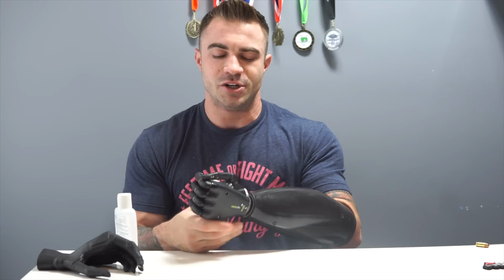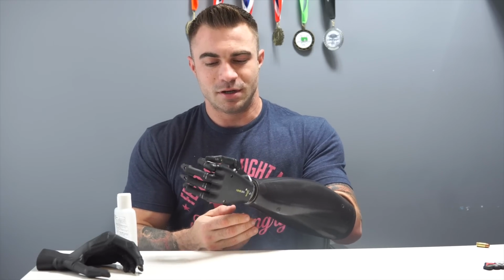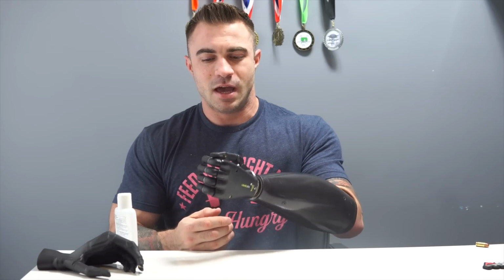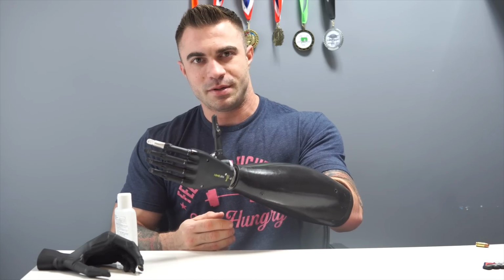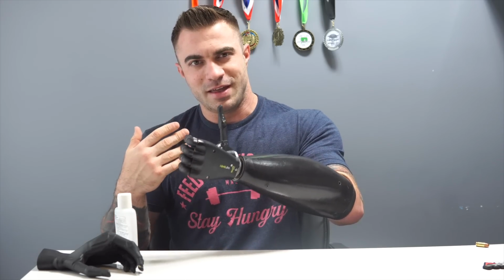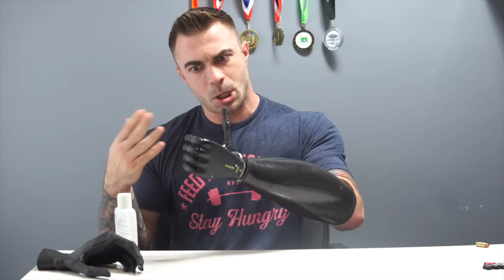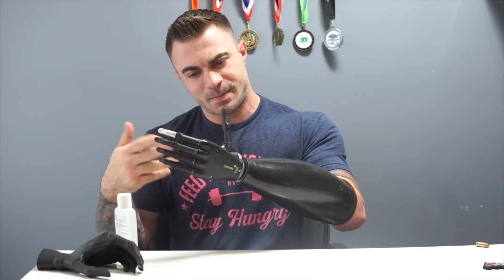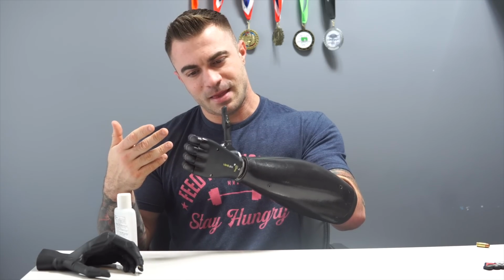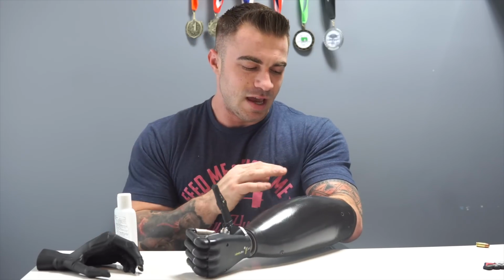I just connected this to the app, so I'm going to show you guys the app, and we're going to go through a few different gestures. Off the bat, without the app, I know how to barely turn it on, apparently. I can open and close the hand, and I have a setting where I can go into a thumbs up position eventually, maybe. And I can just move the thumb, and then I can also open the hand and then just move the thumb, I believe, eventually, sometime. Oh, I'm just going to do it again. That's fine.